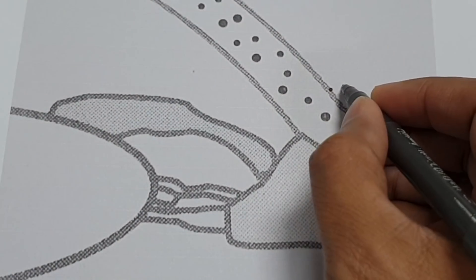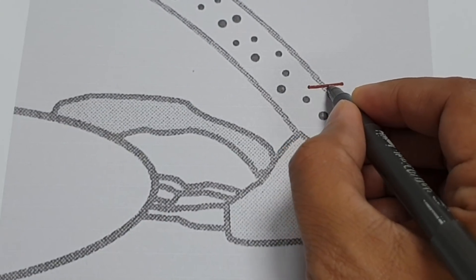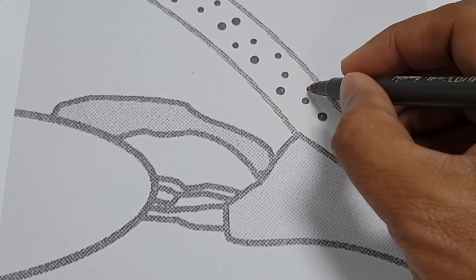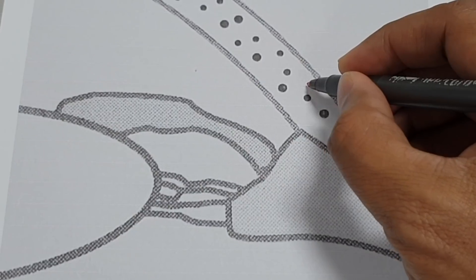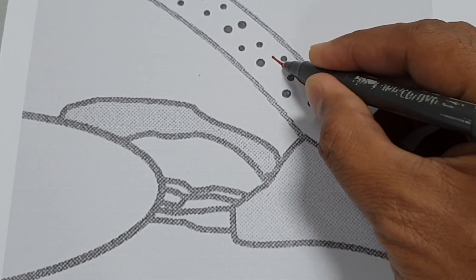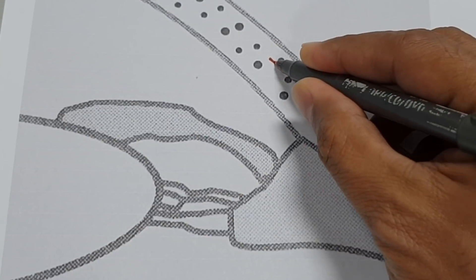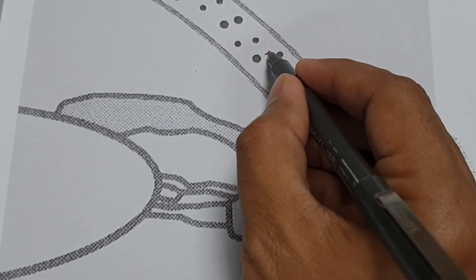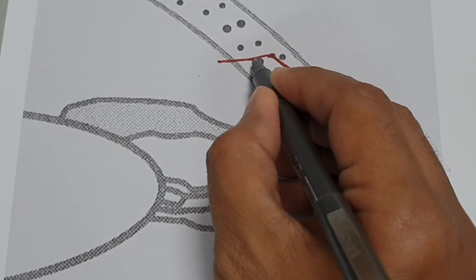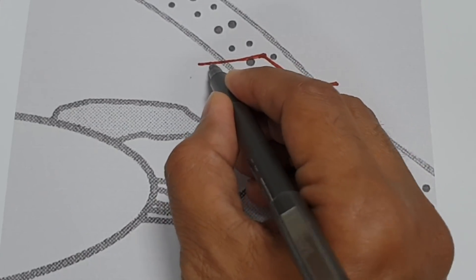First we enter the corneal tissue with the tip of the keratome parallel to the plane of the iris. Then the tip of the keratome is elevated and passed through the corneal stroma for about 2 mm. And then the tip is dipped posteriorly, thereby entering the anterior chamber.